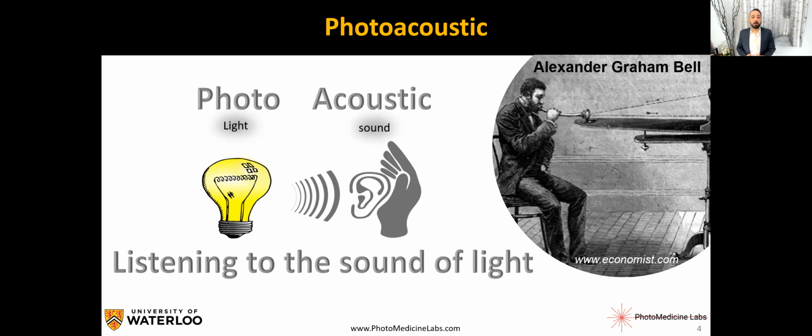at that time. However, I would say in the last 10 to 15 years, thanks to advancement in the field of optics and photonics and laser, photoacoustic became a hot topic and a very powerful technology in the field of medical imaging.